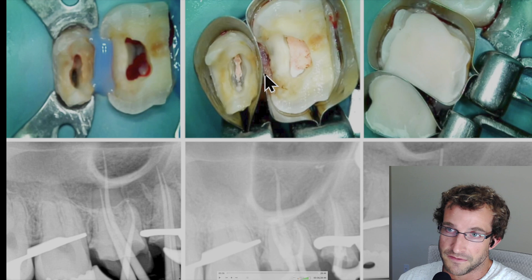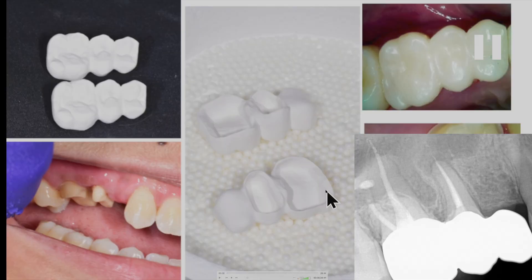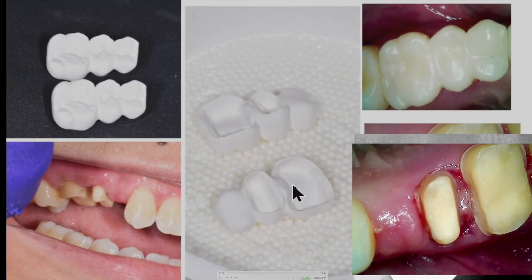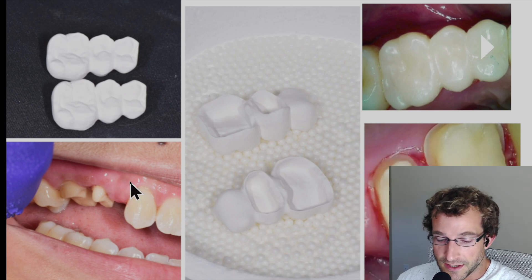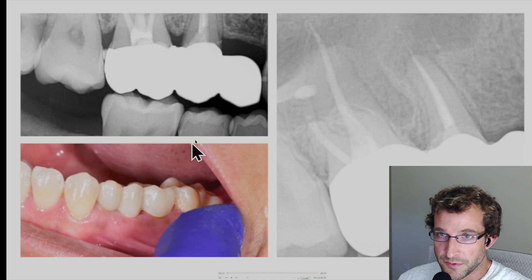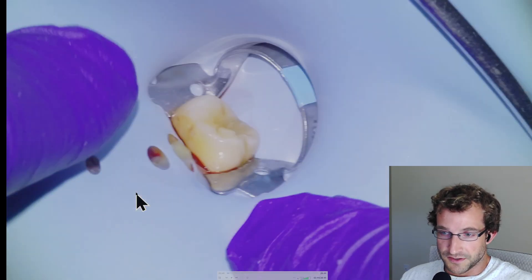Here are some photos of the endo and buildups and then some trial cones. There was our final result there. And then the preps and the cantilever bridges — I made two of them for different shades to get the shade right. So that's the case. We'll get into the footage from the beginning. There's the final result. This trailer footage you can all skip through and we'll get started.